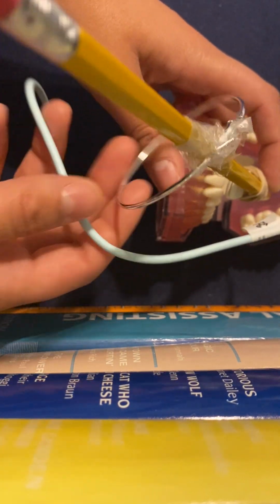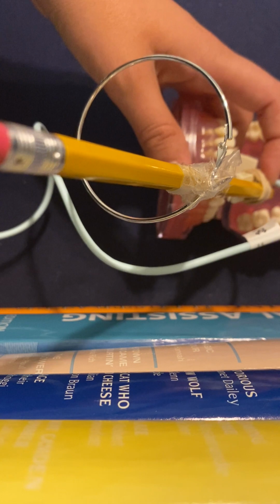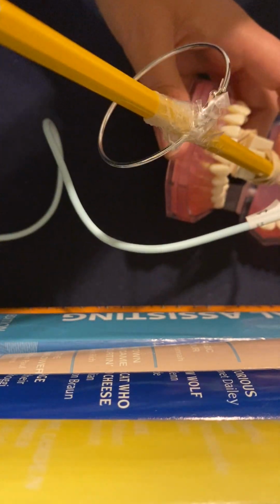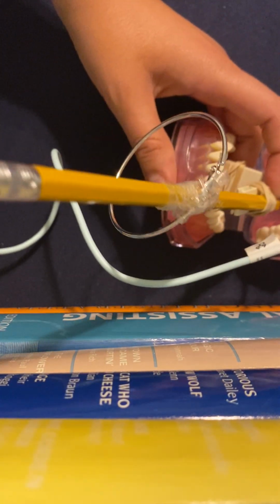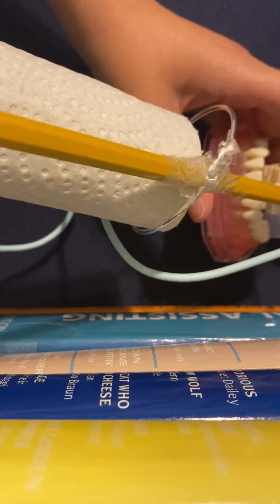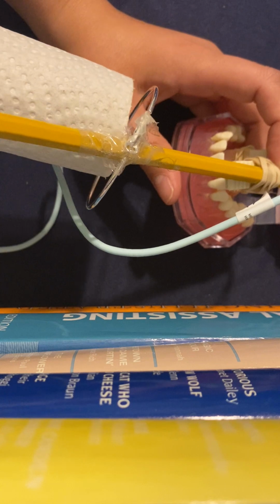And the central ray is going to point down from the tip of the chin or the nose to the chin area. It's going to be very much so like that.